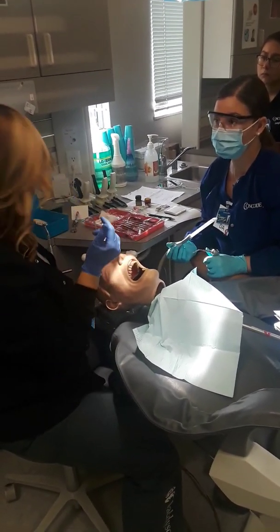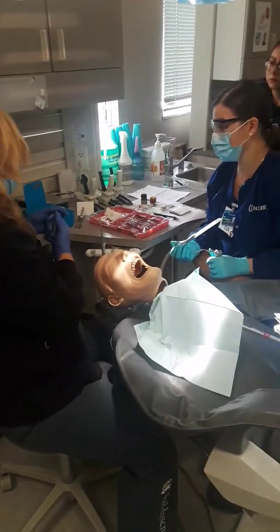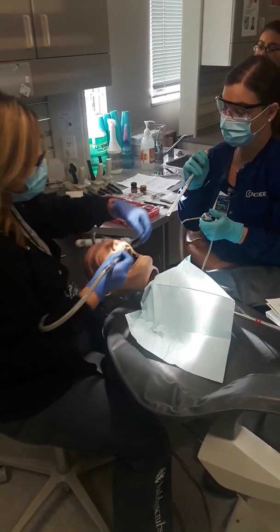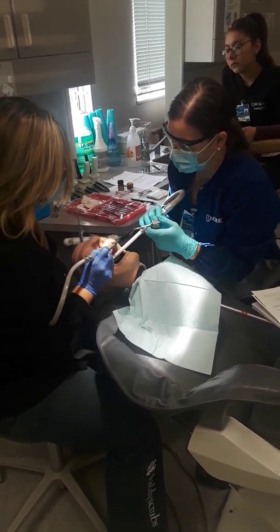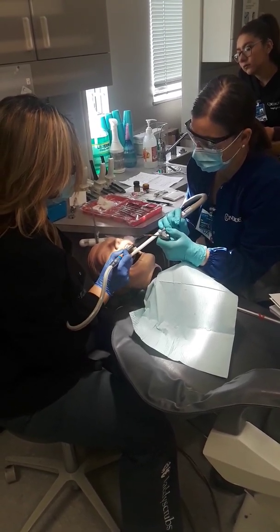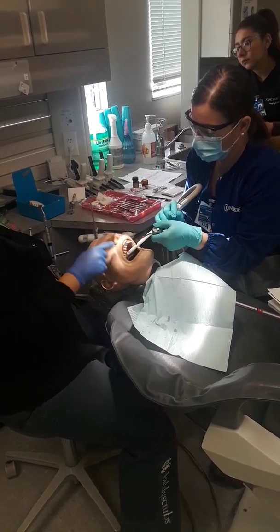And then now we'll switch to a diamond burr and prep for our crown prep. So then the tooth will look like this shape. Alright, and we're ready. Done. So now we look like this.